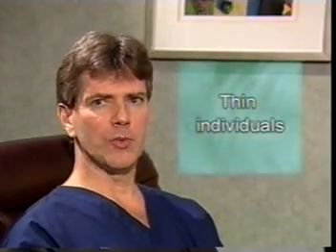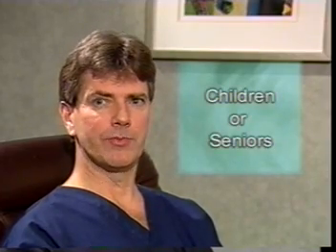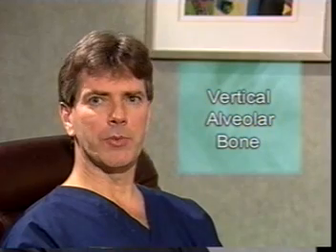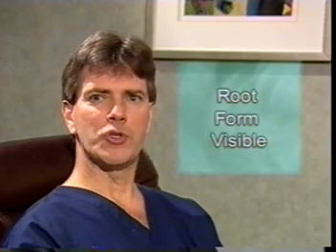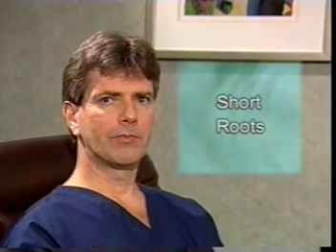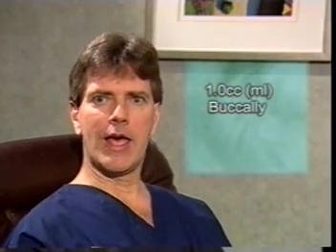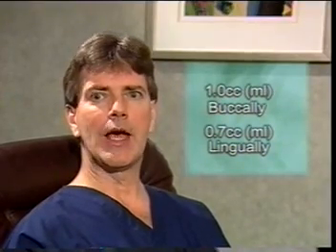As with any procedure in dentistry or medicine, patient selection is important. The following patient criteria should be used when estimating the greatest chance of success with this procedure: thin individuals, children or seniors, pH stable areas, thin cortical bone, vertical alveolar bone, root form should be visible, short roots, and adjacent missing teeth. Each patient will receive 1.7 cc's of Articaine anesthetic solution, involving approximately 1 cc infiltrated buccally and 0.7 cc's infiltrated lingually at the lingual mucogingival junction.